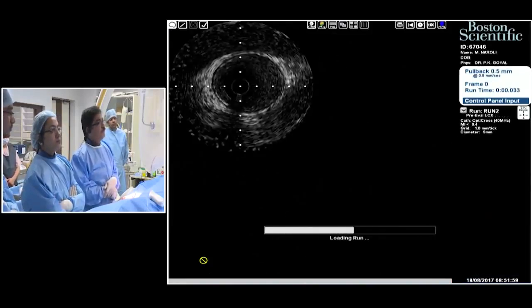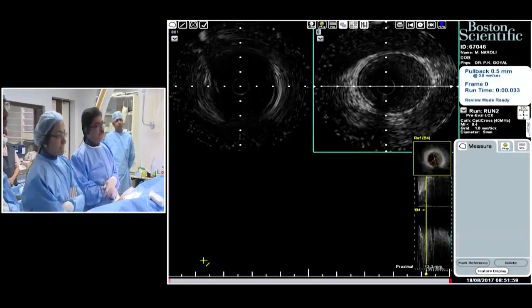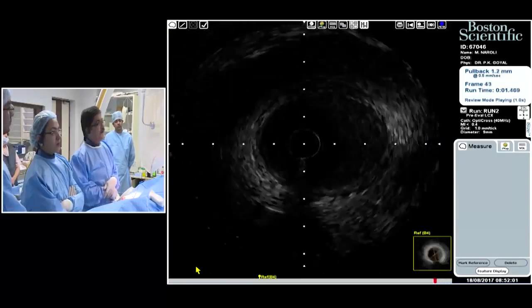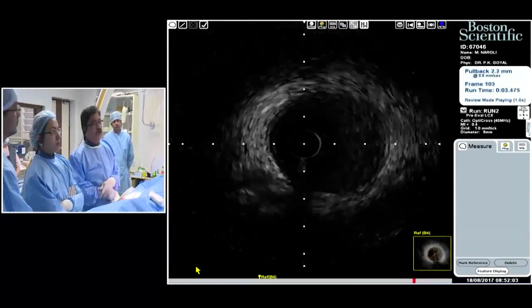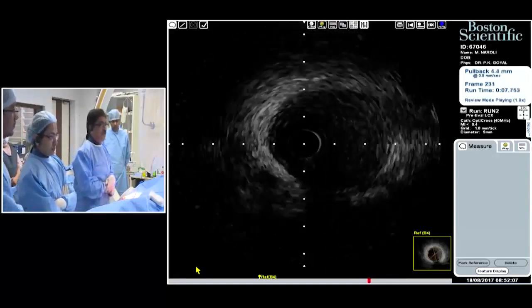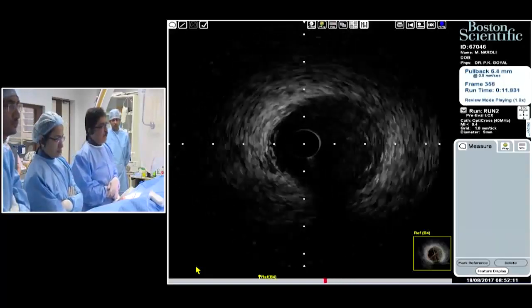I wanted to hear from you, suppose the left main is long and the ostium is free from disease. Do you mind covering the entire length of left main? I'm asking, if your left main only has a distal disease, will you cover the ostium of left main, or only from the normal segment in the left main mid portion? I will not do that. And there is more disease.